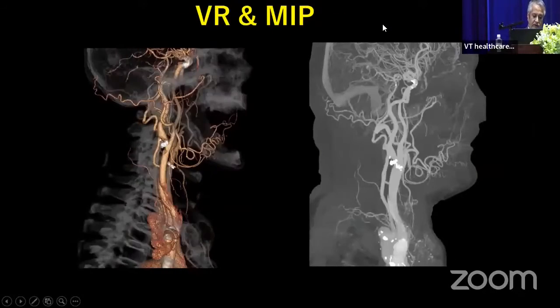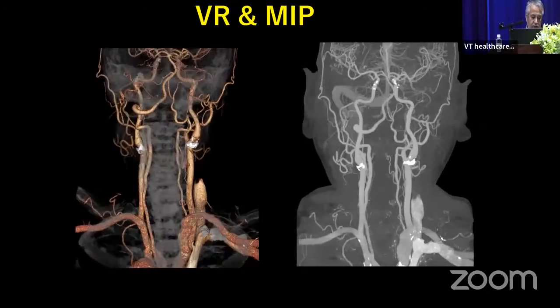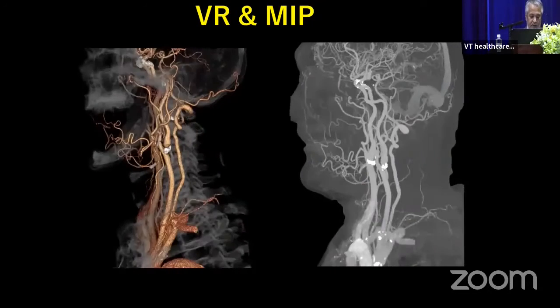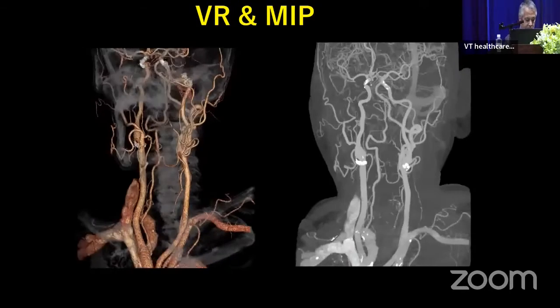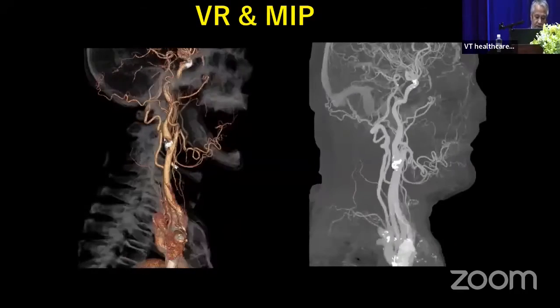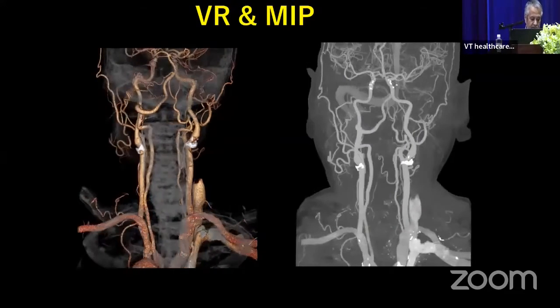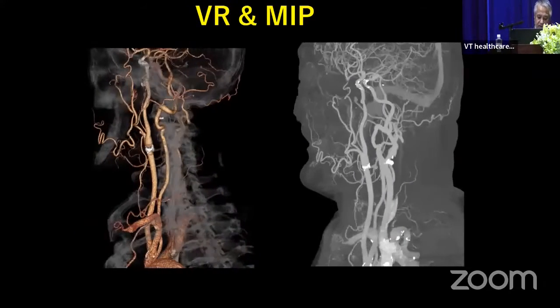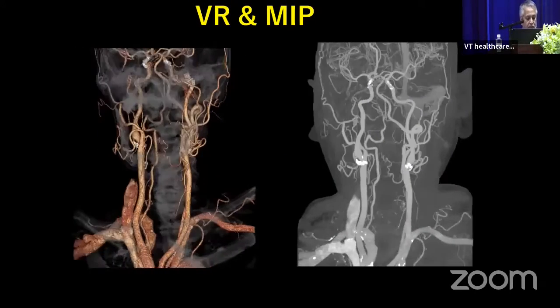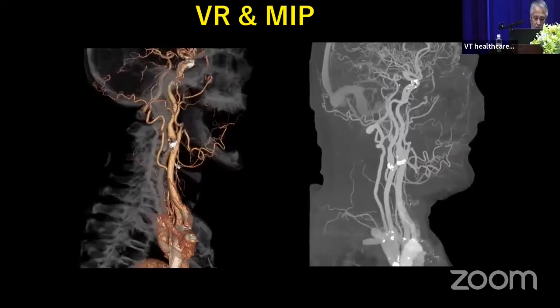Volume rendering is a virtual screen display method that makes use of space, and you can understand the three-dimensional effect and depth. MIP with the same data shows that there is no stereoscopic effect because substances with high CT value are displayed on the projection screen. Images are provided according to each application.